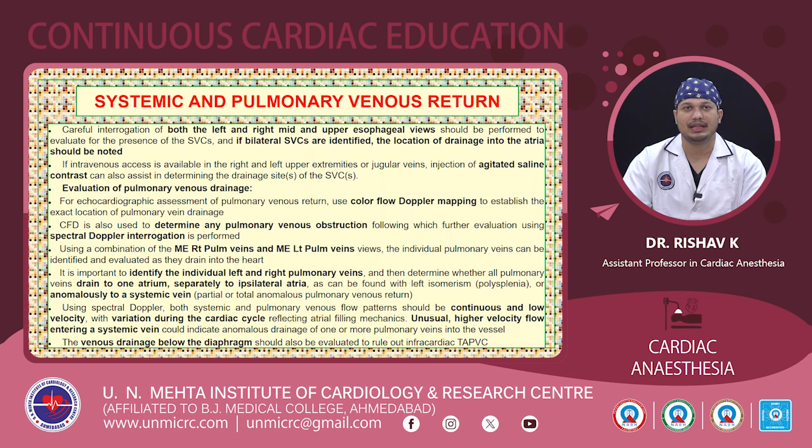It is also important to identify the individual left and the right pulmonary veins and then determine whether all the pulmonary veins drain to one atrium, separately to ipsilateral atria, or anomalously to a systemic vein. So all these variations may be seen in these patients.